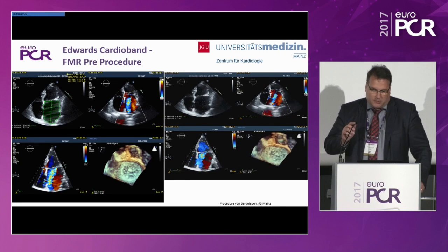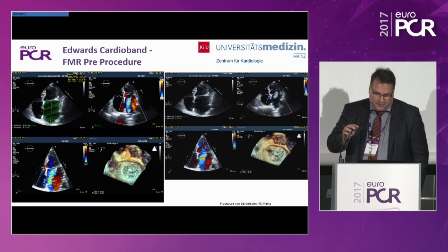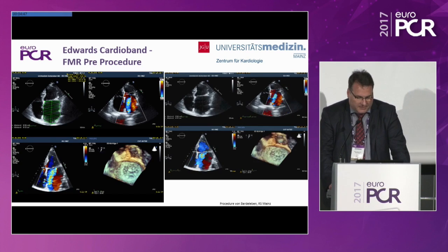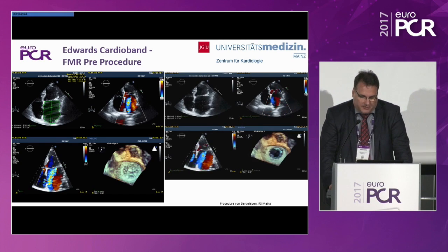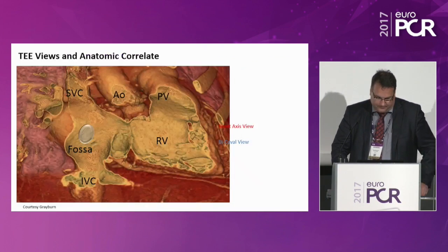So I'll present you this with a patient case. You see there's an extremely enlarged left atrium with a length of about 12 centimeters. This is more than 300 cc. You can appreciate that there is a massive reflux into the right pulmonary veins in this patient, and a typical functional MR with reduced LV function and large atrium.